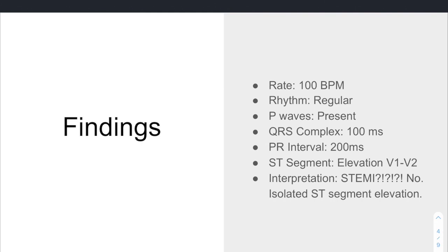To summarize our findings: rate was about 100 beats per minute, regular rhythm, P waves all followed by QRS complexes, narrow complex QRSs at about 100 milliseconds, and a normal PR interval of about 200 milliseconds. We have ST elevation in V1 and V2 particularly, but not globally. So what do we think it is? It looks like a STEMI, but it's actually not — this is isolated ST segment elevation in just those two leads.